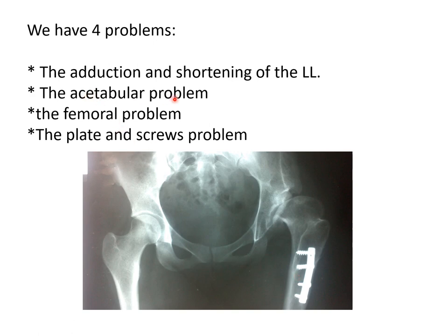We have the acetabular problem, which is large and shallow, and this should not deceive you while doing the total hip replacement. If you ream the whole acetabulum, you will end up with proximal migration of the center of the hip. You have to be careful and do your reaming in the lower part of the acetabulum.